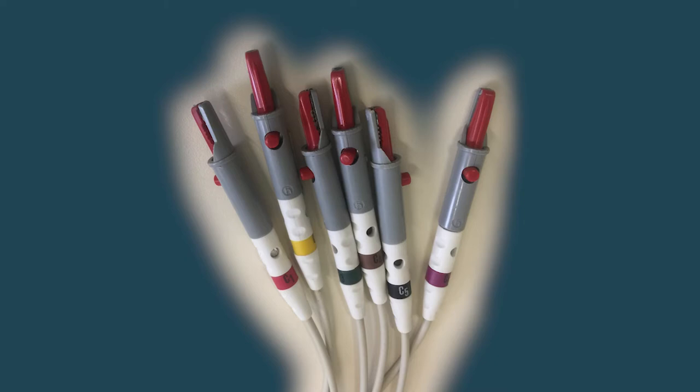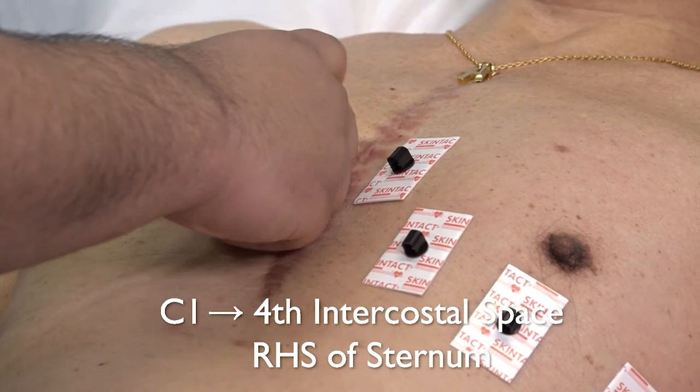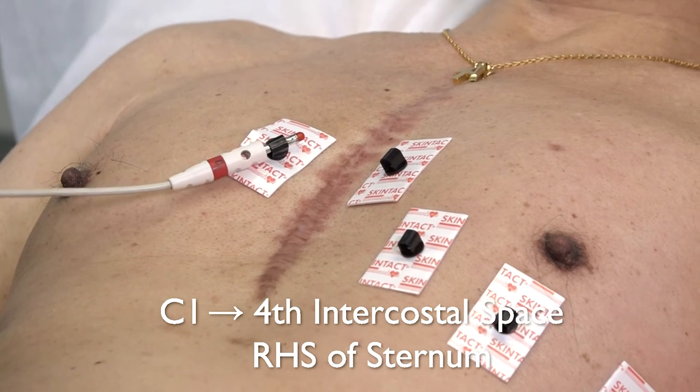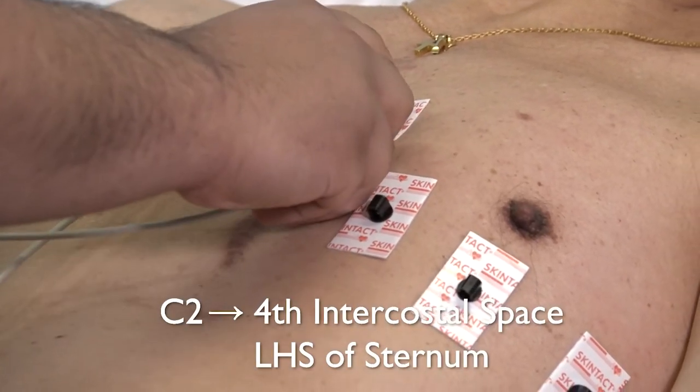You now need to attach the six chest leads to the six electrodes. Start by attaching C1 to the electrode placed to the right of the sternum, then continue in numerical order.